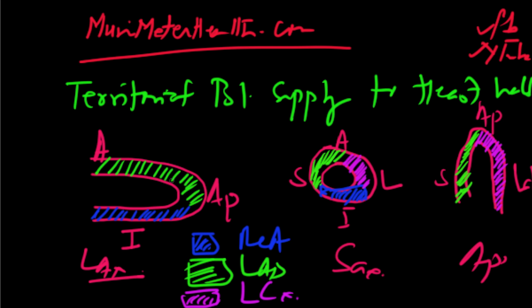And so that's typical of that territory. Likewise, you could say a lateral ischemia was present. Why? Because there was a reversible defect in the lateral wall, and that reversed fully. Now, if there's a fixed defect, then there are only two things.